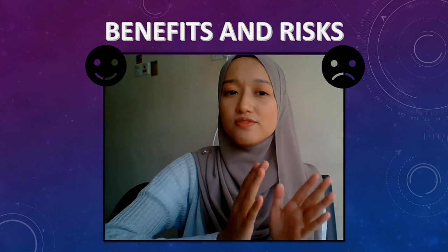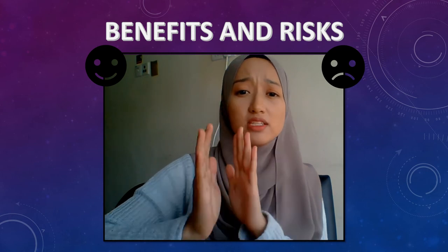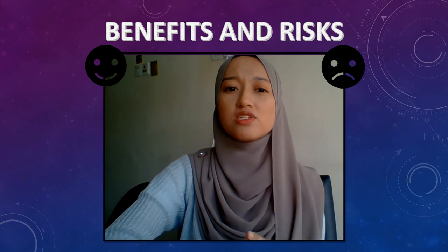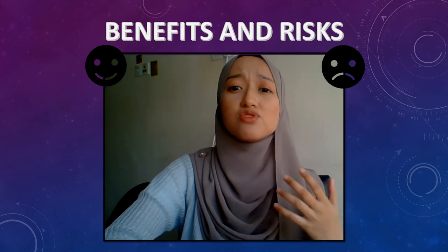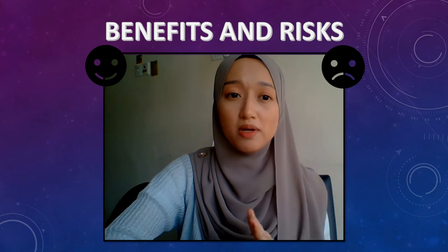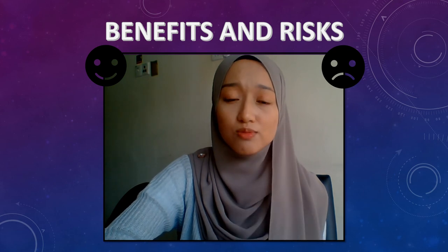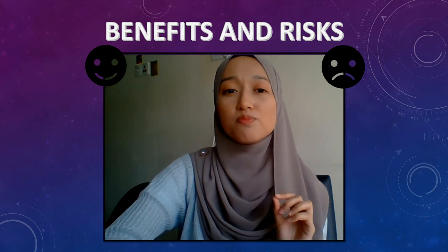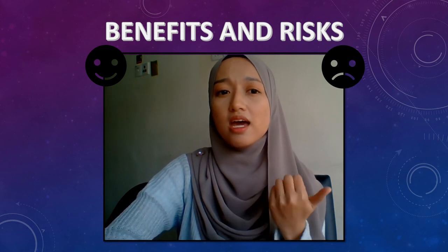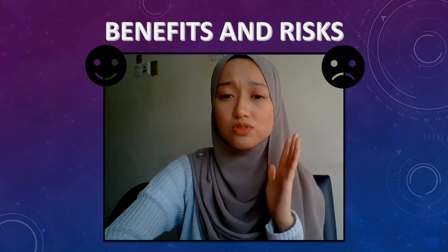Okay, let's go to the benefits and risks of spinal angiography. Spinal angiography is a safe and effective procedure, and complications rarely occur. The primary benefit of spinal angiography is that it provides extremely sharp and detailed images of the blood vessels, arteries, and veins in your spine. This allows your doctor to create a safe surgical plan that reduces unnecessary bleeding and other complications. Other benefits include that it's a minimally invasive procedure, typically performed in an outpatient clinic, so you may go home the same day as your test.